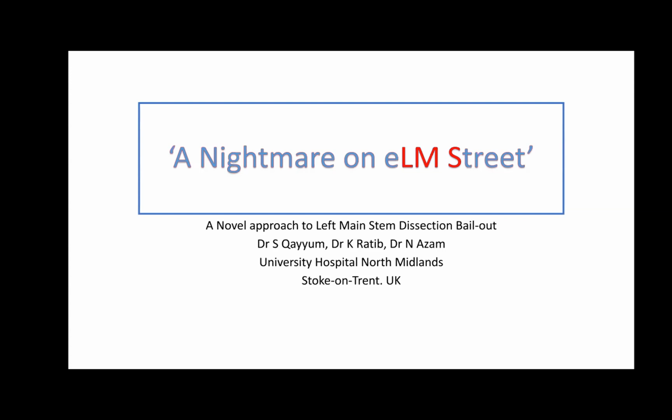One is whether it is stenotic and whether that's significant. The other, I think, is that it was a lesion which was probably borderline significant, but it was an unstable lesion. So OCT on top of that will tell you that yes, it's a ruptured plaque with some thrombus. But I agree with you, it would have been a bit of a struggle in this case.